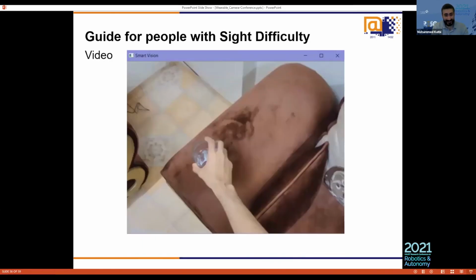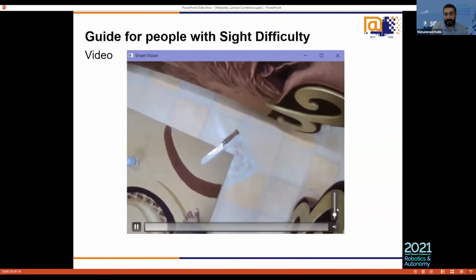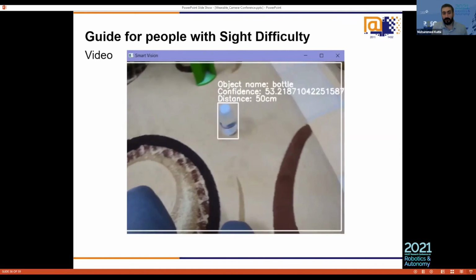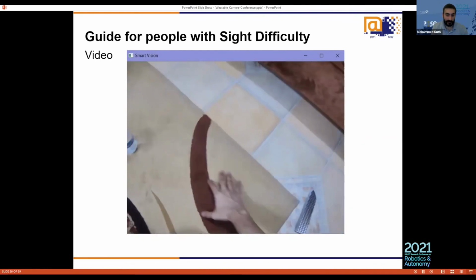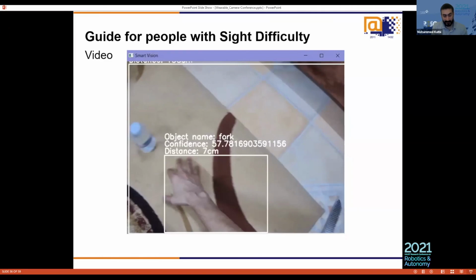And here's a small video. It's very new, the project still isn't finished. Is 30 centimeters away from you. It allows the person to start seeing what's in front, and gives them the distance. It's all through voice command, and this is supposed to be on headphones, so the user will get all this feedback while still navigating the environment.